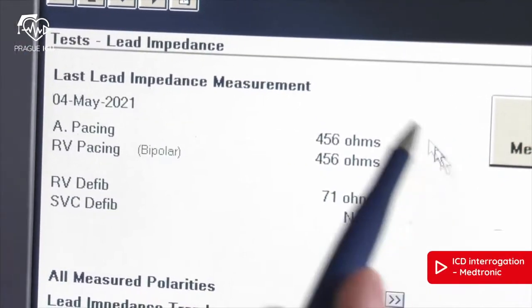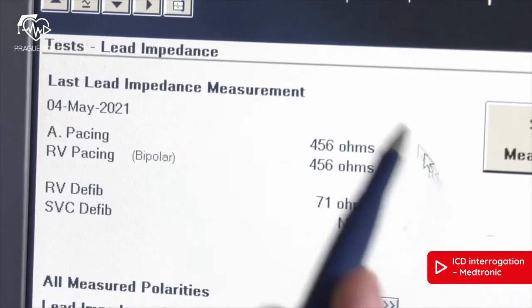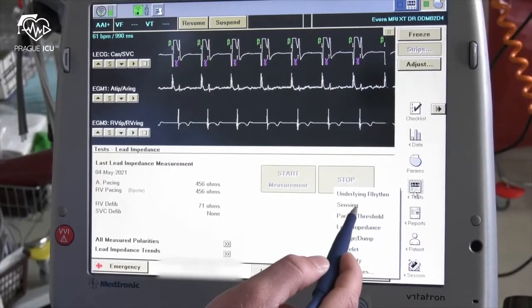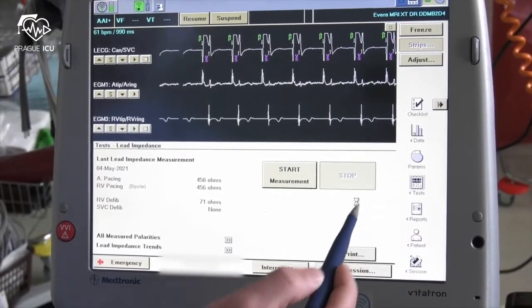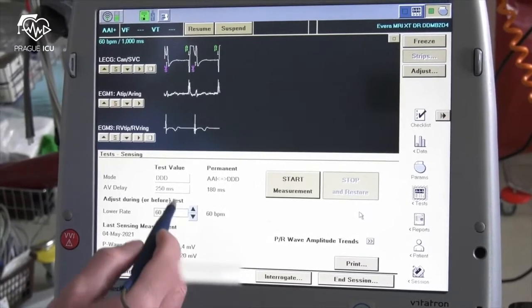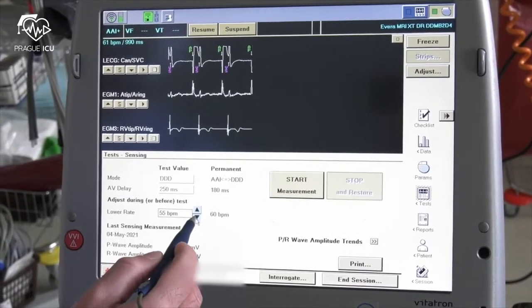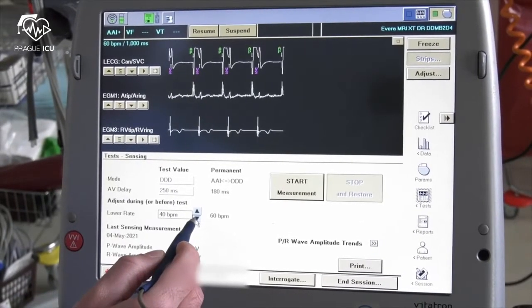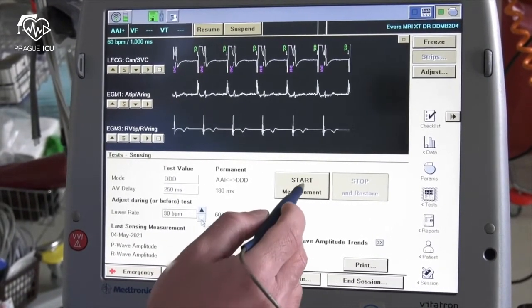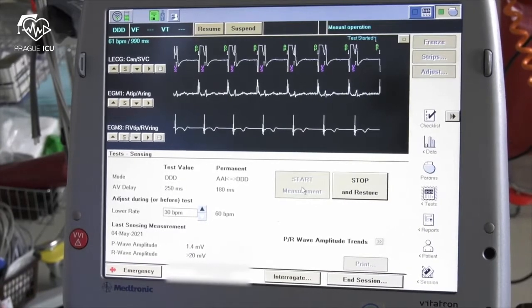For sensing measurements go back to test and choose sensing. Change the lower rate to 30 beats per minute and click to start measurement. Measured values will appear in the left lower part of the screen.